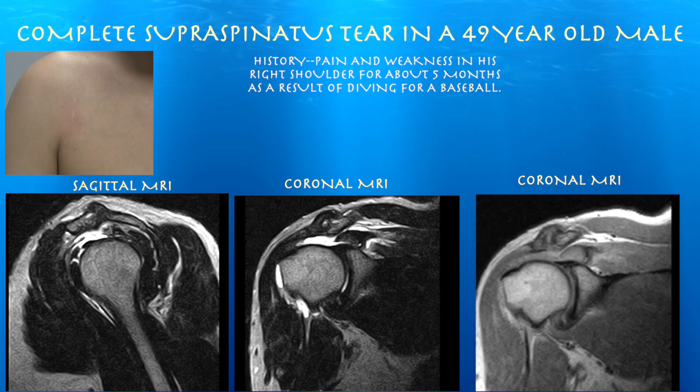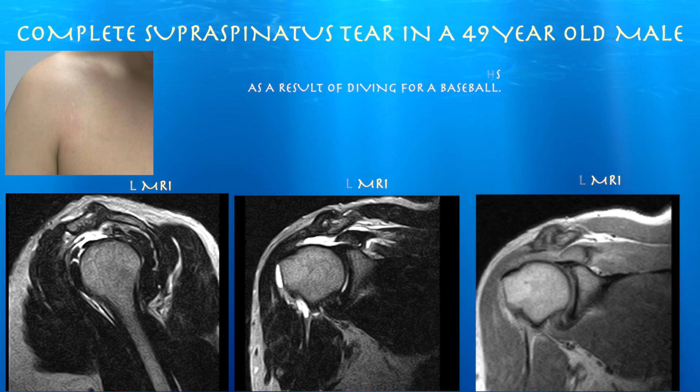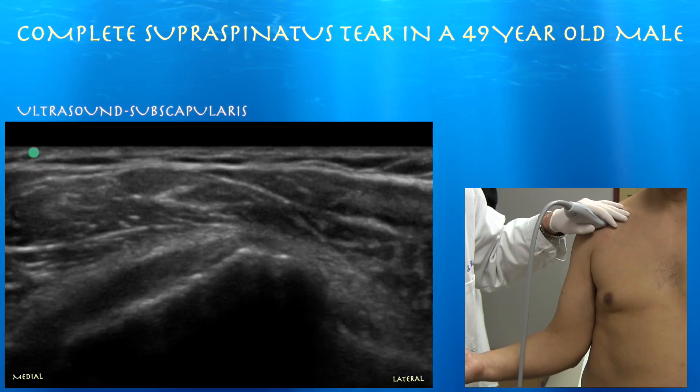I'm just going to go ahead and look at it on the ultrasound, just to see what a full-thickness tear appears like in a 49-year-old male. Here's our first clip.